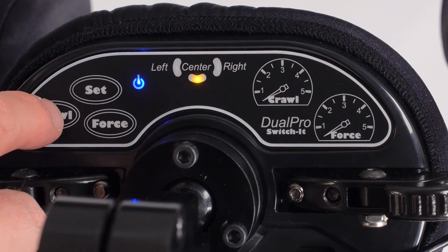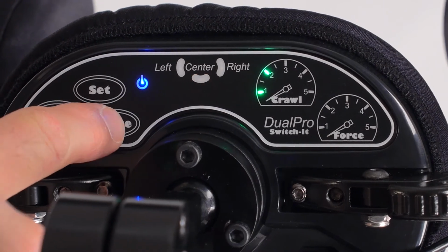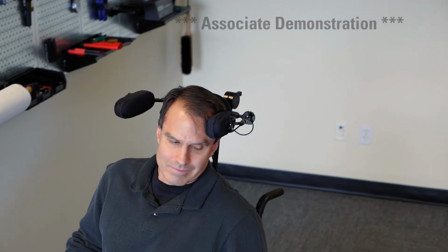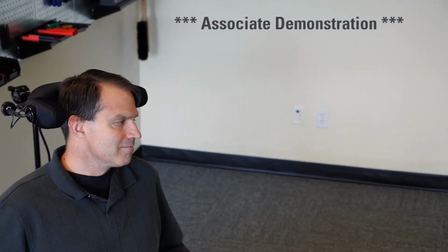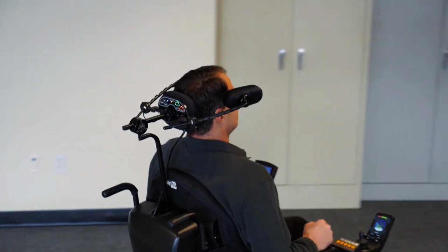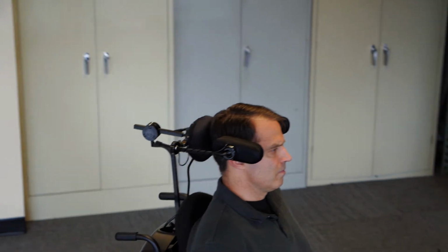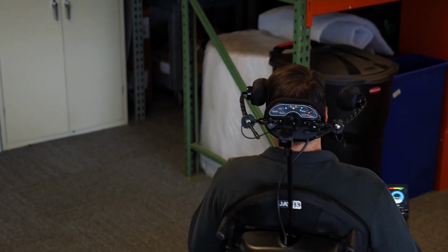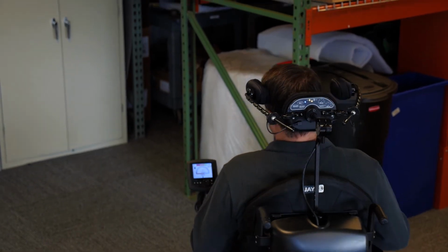This ability to control the chair using both proximity and force has some unique advantages. For example, take a patient in the early stages of ALS. They may be able to press against the pads to control the chair. However, as the disease progresses and they begin to lose strength in their neck muscles, they can simply move to a proximity-driven platform without changing to new equipment.